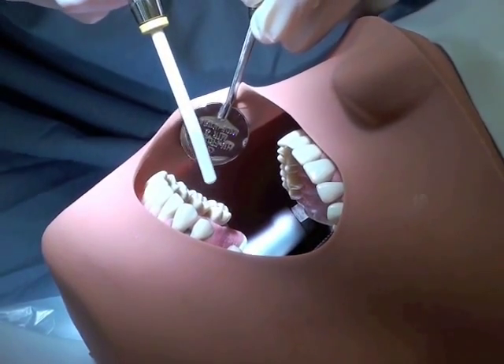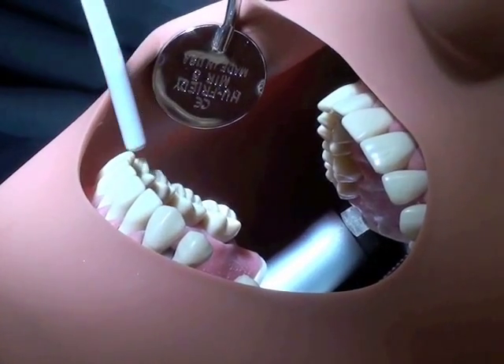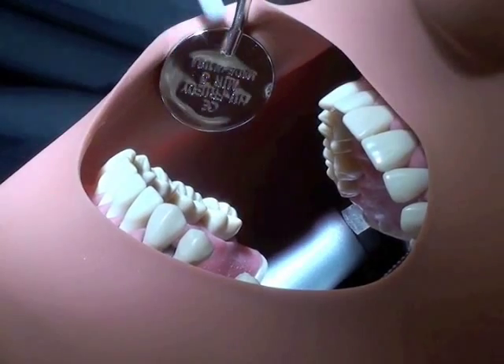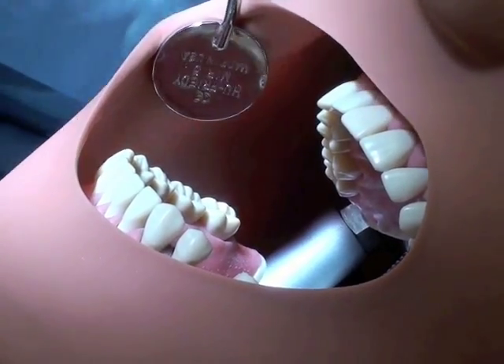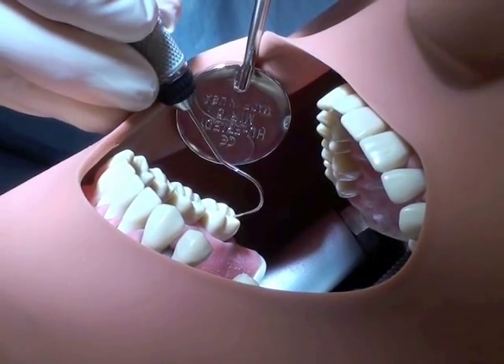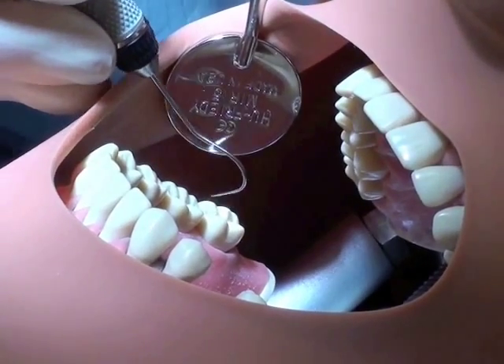The best way to begin is by drying off the tooth surface with the air water syringe. Once that has been completed, you can visualize each tooth. Should there be any organic plugs or material inside the grooves or pits, you can remove it with the 23 Explorer.